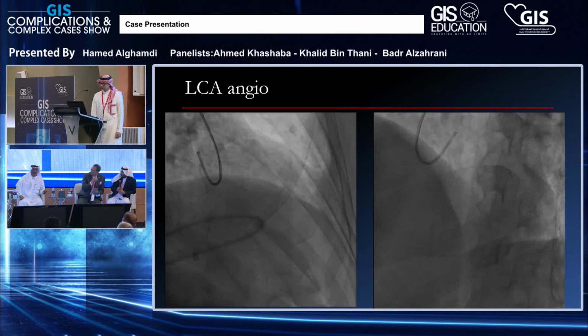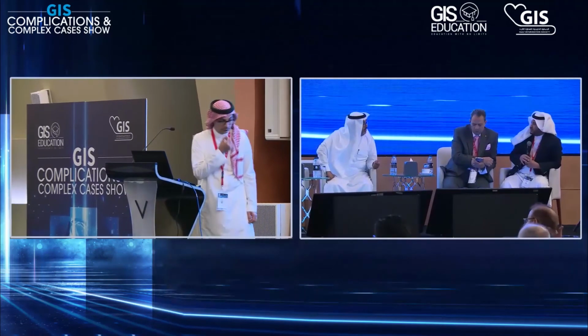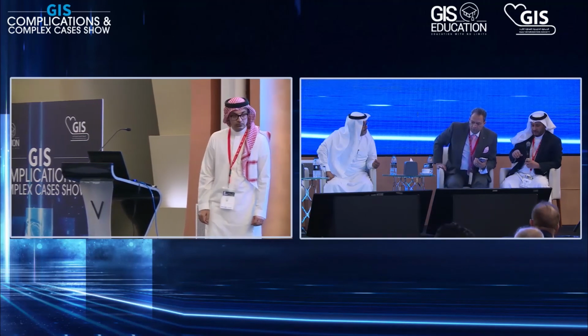Okay, Hamid, here we are trying to learn. I guess for everybody regarding the Lucas device, there is also some data regarding cardiac contusion with using it, so placing it correctly matters. I don't know if any other places use it. We stopped using it, to tell you the truth, because of this fear of cardiac contusion. This is my pearl of wisdom here for everybody.